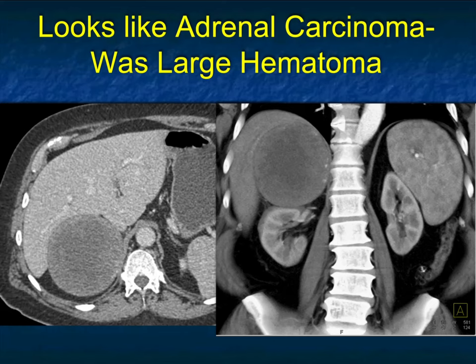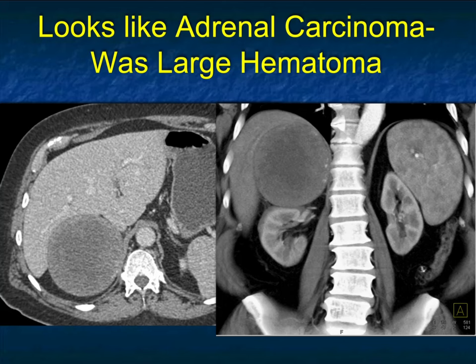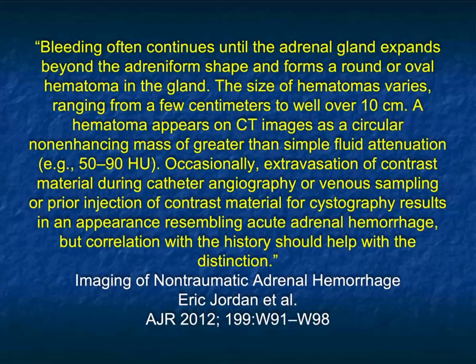Here's another case — patient presented with vague symptoms and a large mass over 10 centimeters, cystic with a more solid periphery. Could this be a necrotic tumor? Going through the differential, could it be a pheo — though we don't see hypervascular features, pheos can be cystic with rim-like enhancement. This was a large hematoma at pathology, but it was a benign lesion — an adenoma. The diagnosis can be very difficult.